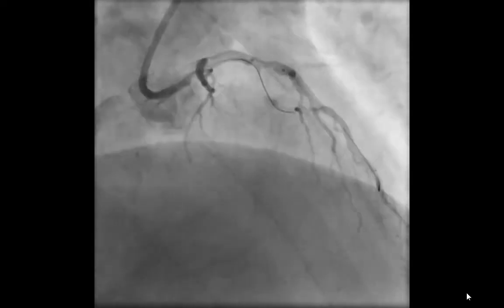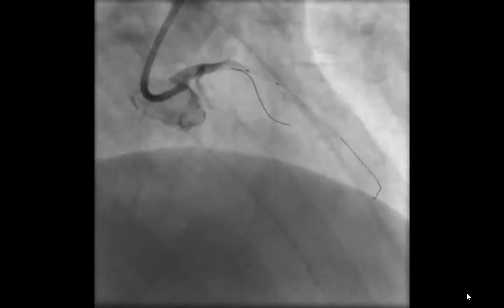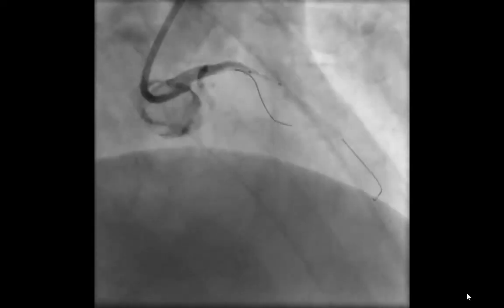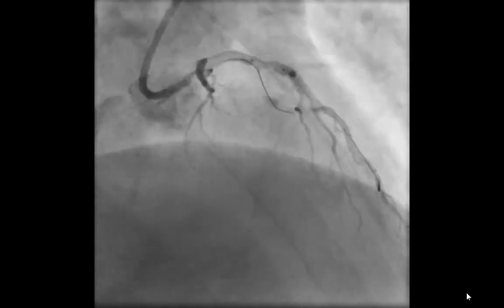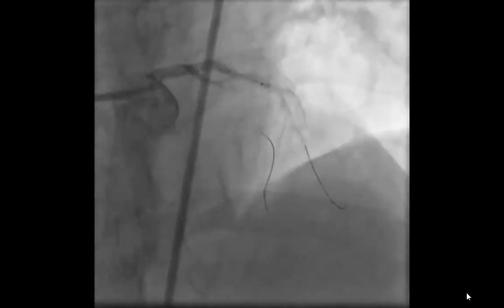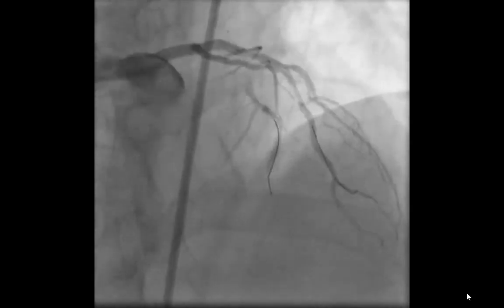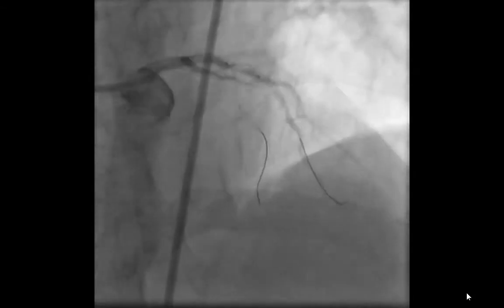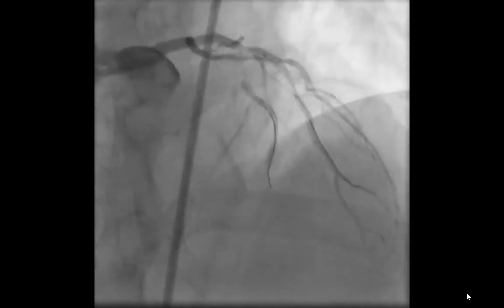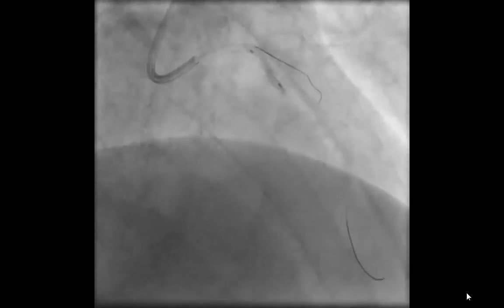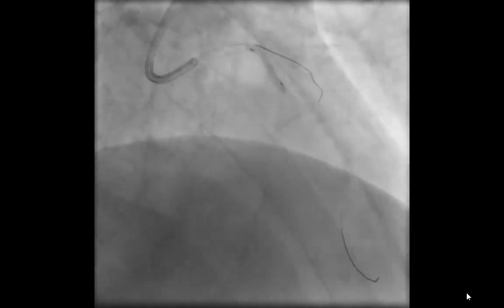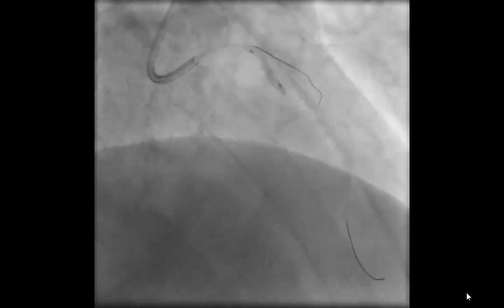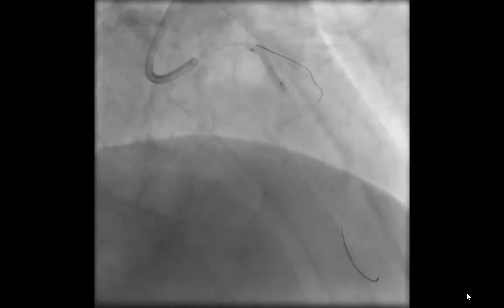And you can see here, with very little manipulation and due to the support provided by the twin-pass catheter, the Confianza Pro 12 could penetrate the proximal cap and is now traversing into the distal vessel, which appears to be fairly healthy. This was confirmed by antegrade and retrograde injection, ensuring that we are in the true lumen before advancing the wire further since it was a stiff wire. At this point the twin-pass catheter was removed, and now we have purchase on the LAD occluded vessel and a large diagonal branch.